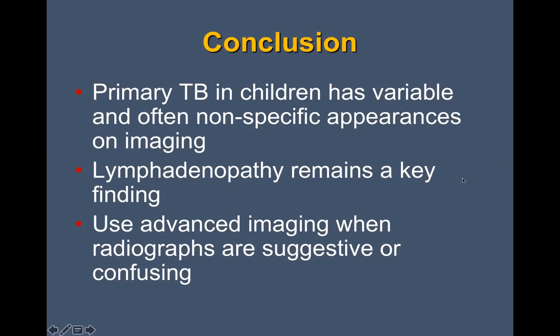So we do have, well, first of all, thank you, Dr. John, for that very visual presentation. We do have two questions in the Q&A box. The first question has multiple questions within one. So she asks, or I don't know if it's a she or he, for what ages of children do you recommend PA and lateral chest X-ray? Is 5 and under sufficient, or do you recommend 2-view for older children as well?